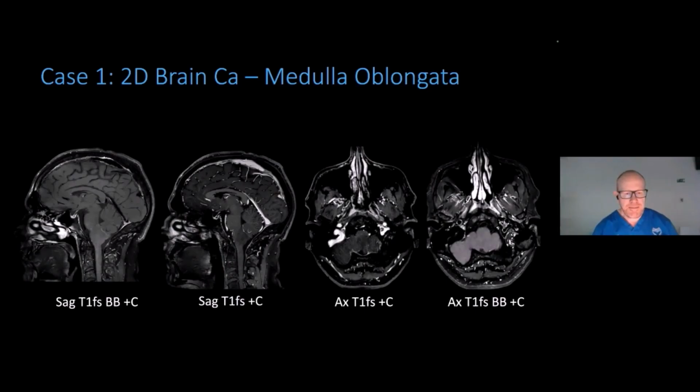Another thing is in the post-contrast here, we can see there's no real enhancement, both in the black blood as well as traditional T1 FATSAT plus contrast. Now, when monitoring tumours, often the rate of enhancement or the DWI restriction or ADC maps can be quite valuable for looking at progress of tumours along the way, but we have none of that here.